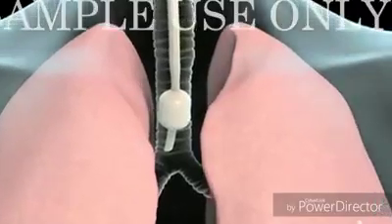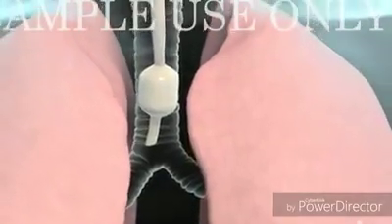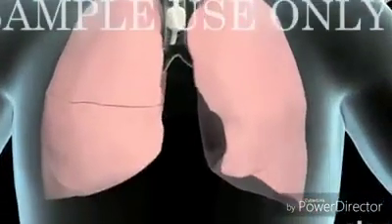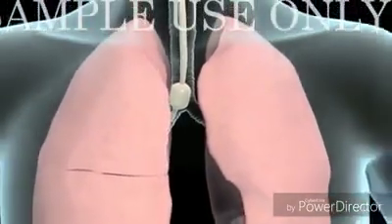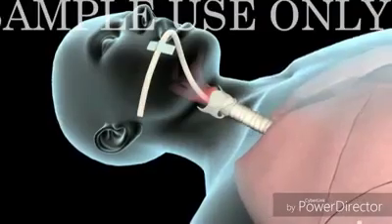After fixing of the endotracheal tube, the air entry in both the lungs is checked. The air entry in both the lungs is checked with the help of the ambu bag. With the help of the ambu bag, the expansion of the lung on both sides is observed. Sometimes there is a possibility that the endotracheal tube may inflate one of the lungs and the other lung remains as it is. In that condition, you can take a chest X-ray to look whether the endotracheal tube is placed in situ or not.